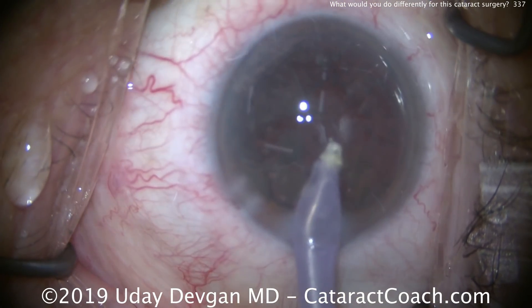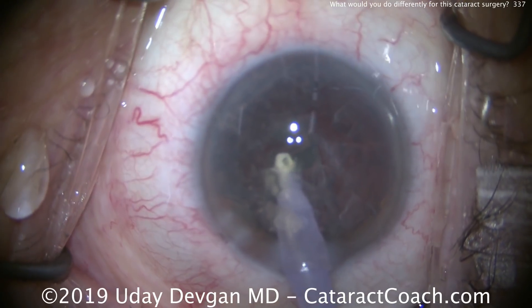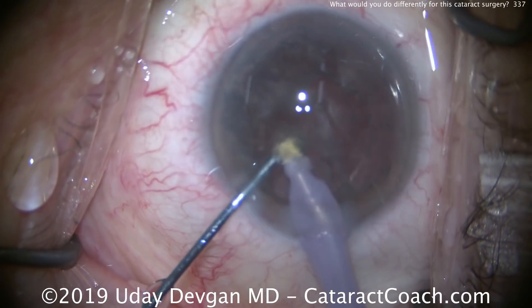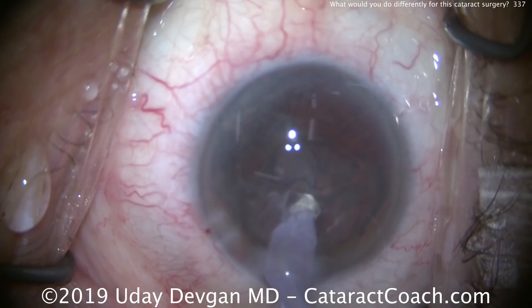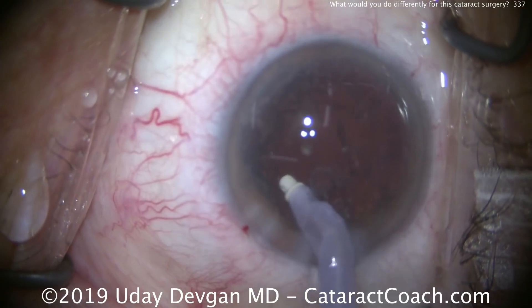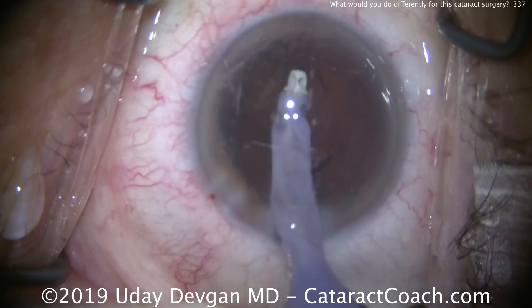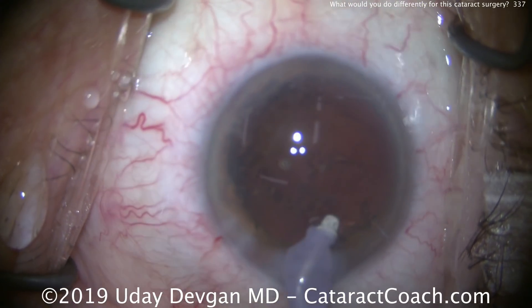Let's fast forward ahead. Here's the end with the cortex removal. As we remove the cortex, you'll notice there's still a very nice covering of the endothelium with the viscoelastic — you can see that with those microscopic bubbles from the beginning of the case. So we'll clean up the cortex from the eye, clean up the anterior segment. My goal is to run as little fluid through the eye as possible.